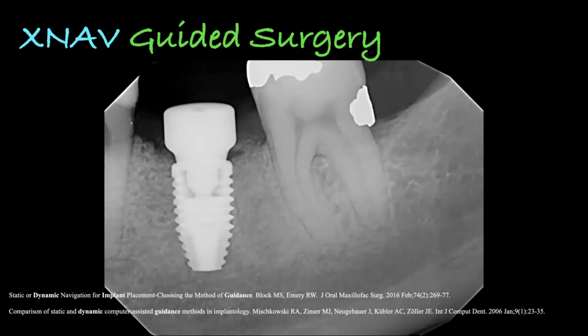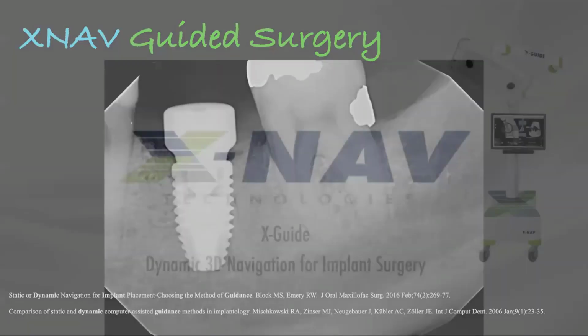And there's that implant placed exactly where they want it to be, where Dr. Long wanted it to be, based on the plan that was done based off of a cone beam CT scan. The beauty of real-time guided surgery is you don't need an impression. You just need a cone beam CT scan machine, and then you need the software and of course the unit to do the work, which is pretty instantaneous and allows you to do stuff.